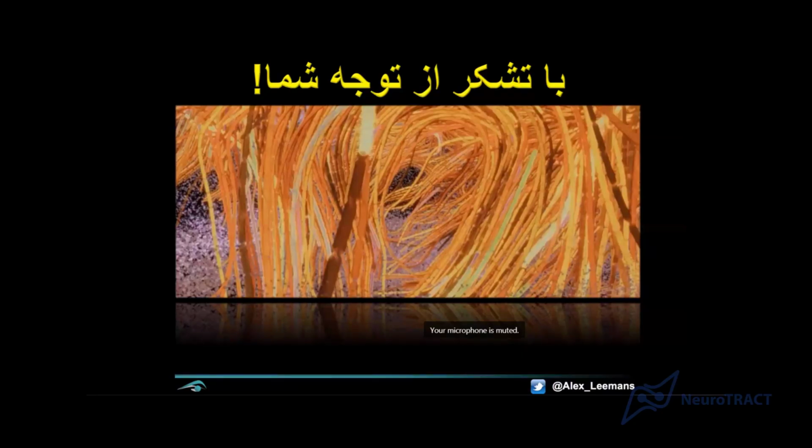So if that surface-based atlas showed similar regions compared to the volumetric-based ones, then the only difference is the implementation of the actual framework. In ExploreDTI, the way it's implemented is that everything is volumetric-based. So when you're doing tractography, if a point at some point literally falls in an ROI, then it states it's connected to that region of interest.